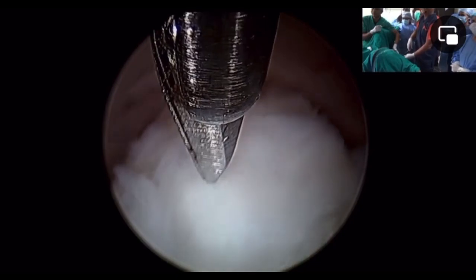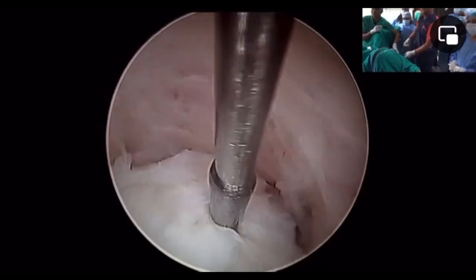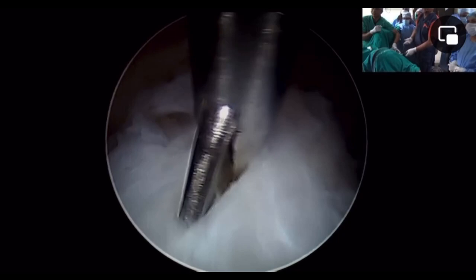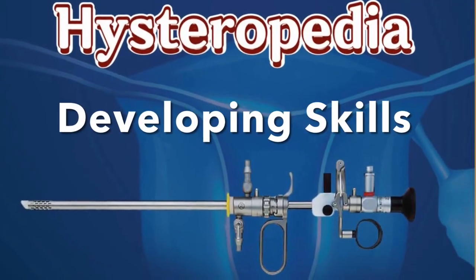And here I share with you a very nice trick that I use with the scissor. You stab the myoma with the scissor, open the blades, and use it as a grasper to pull the myoma down. My dear friends, I hope you like this technique.